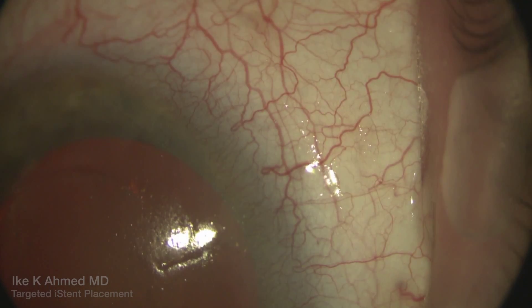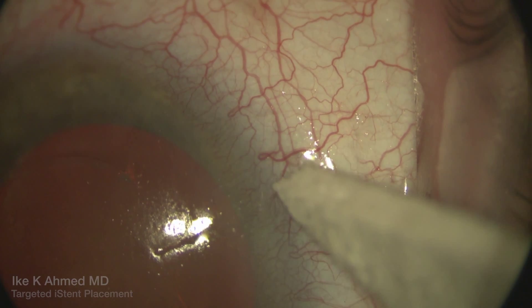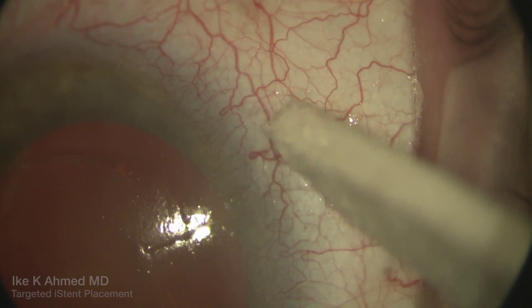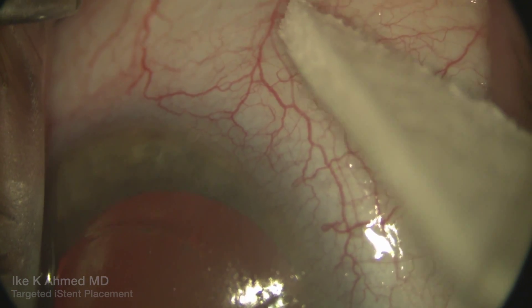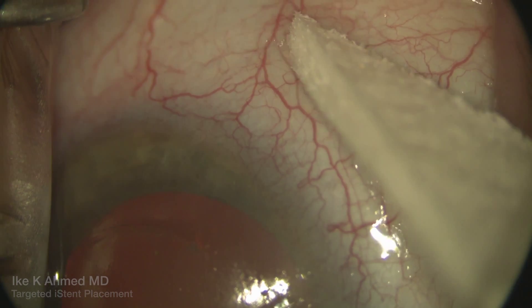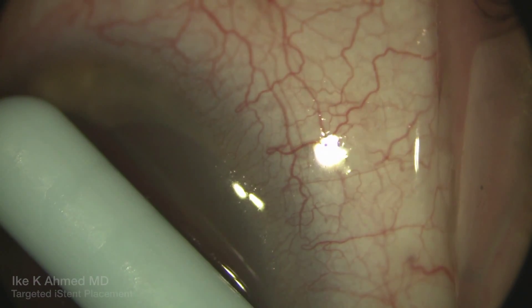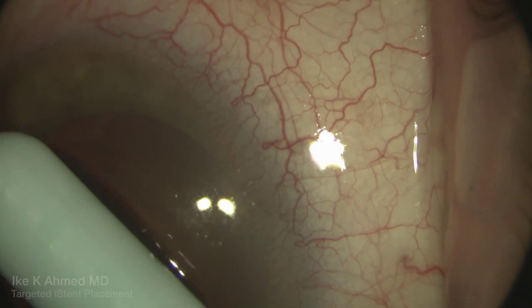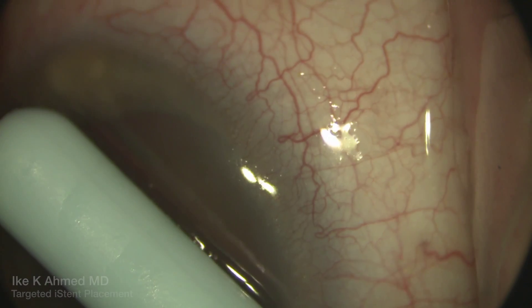These are episcleral veins that are larger caliber, 50 to 100 microns in size. In this particular one, you can see it courses more of a tangential pattern and then heads back more posteriorly, radially.